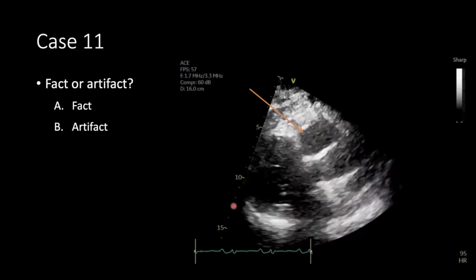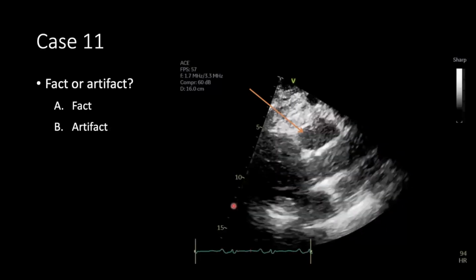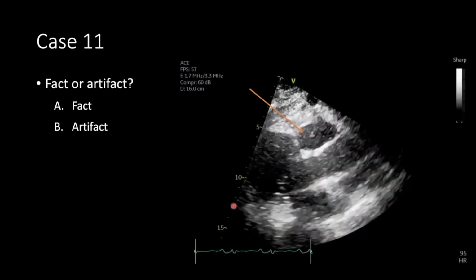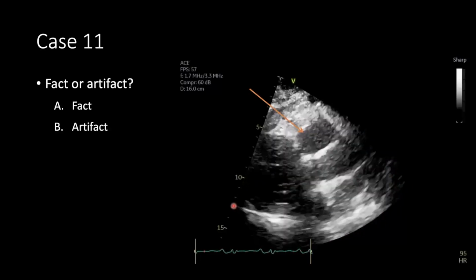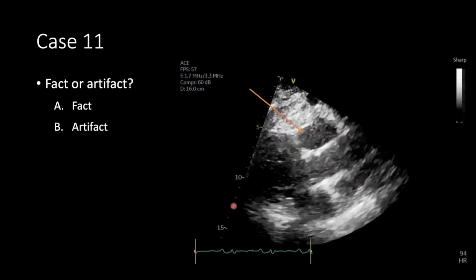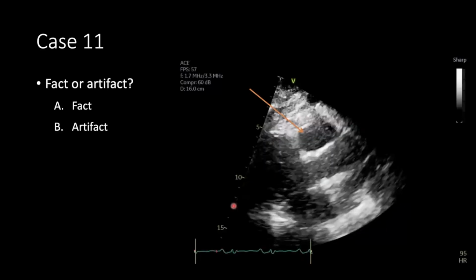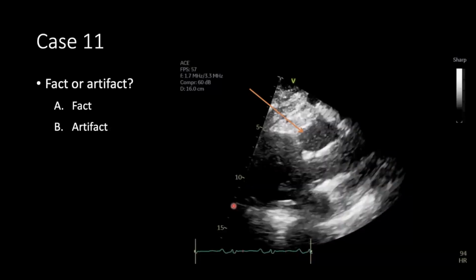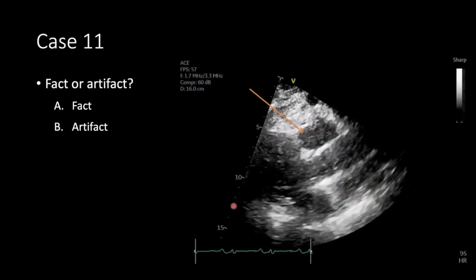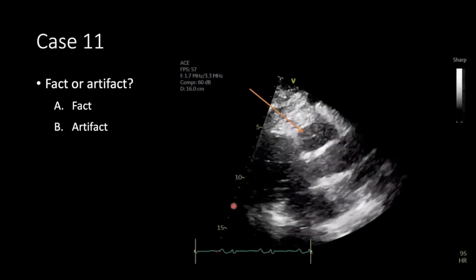I've actually struggled through quite a few of these over the years. One of the things that helps is that sonographers do a sweep. You see something weird like that, do a sweep. Then it sometimes becomes very clear on the sweep. Use of 3D also definitely adds. Way back when, I miss the videotape, because when you record it you actually have the sweep, with the patient breathing in and out, and you can decipher that. You actually get more information on the videotape way back when.